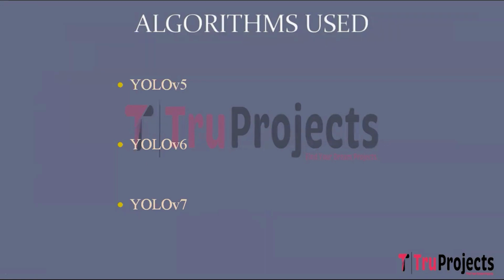Coming to YOLOv7, this model introduces a key difference by using EfficientNet L2 as its backbone network. Compared to the backbone used in YOLOv5, EfficientNet is known for its efficiency with fewer parameters, and YOLOv7 also employs a novel dense anchor box generation method to improve object detection accuracy.